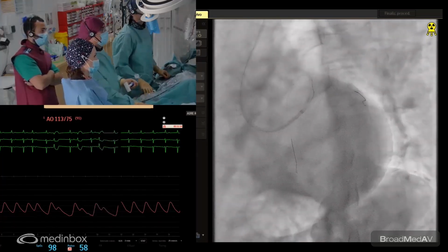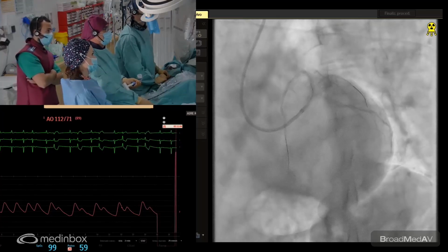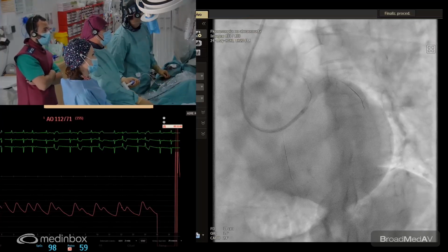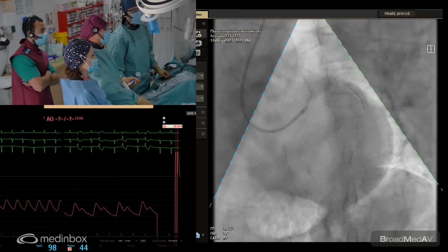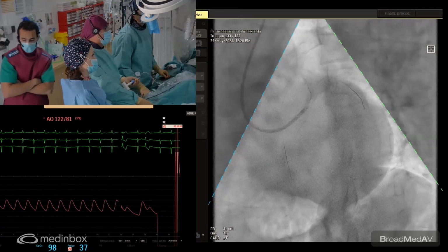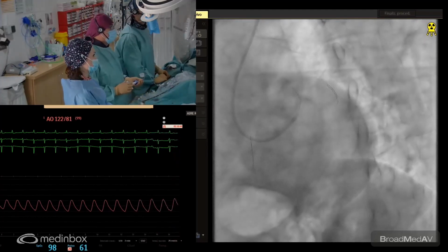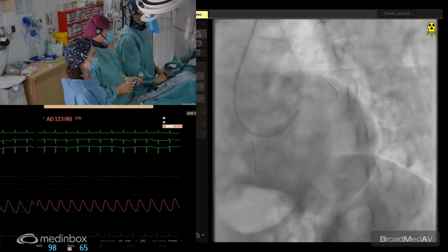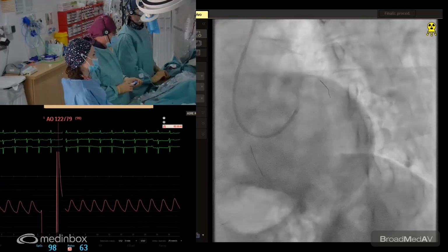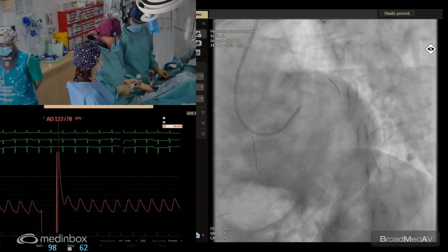Let's check in the spider view where we are, because we are near the ostium of the left main. Test, please. Ok. A little bit more proximal, do you think? Yes. The distal lesion we don't want, the one where we were going to land more distal. Yes, but it doesn't look so calcified, does it? There is calcium there, eh? We have plenty of pulses. Okay, so we give the proximal one first and then try to cross distal. Yes, perfect. I'm going to retrieve a little bit the shockwave balloon. Just here, test please. Probably there. Yeah. Okay.